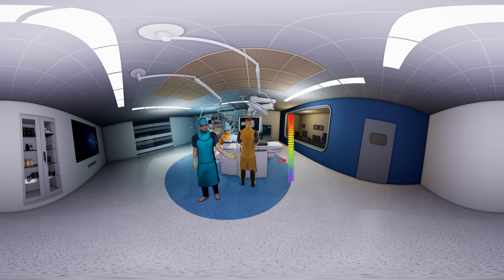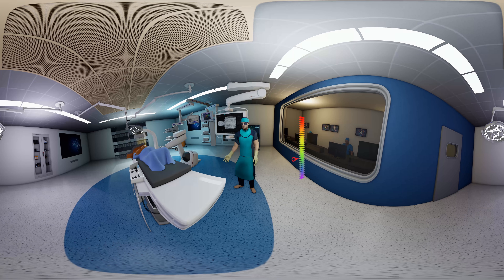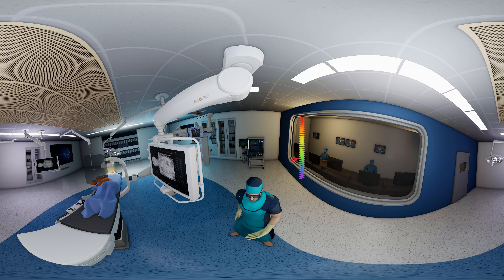Notice the difference with the dose exposure? Here, with the latest LED technology, the whole patient's body is lit up using dual heads giving a wonderful fisheye effect over the table range. Mavic supplies the GD60, a robust and versatile suspension system which carries large monitors showing the inputs of medical devices. Its patented cardonic joint offers security during accidental collisions. An additional medium-sized monitor suspension system, the GD50, can be installed on the other side of the table.